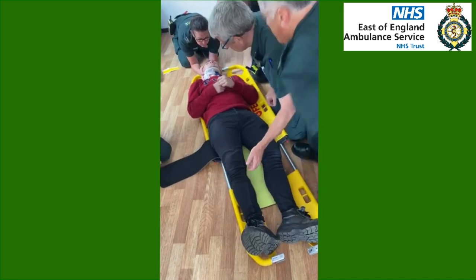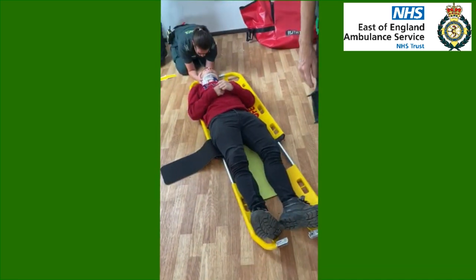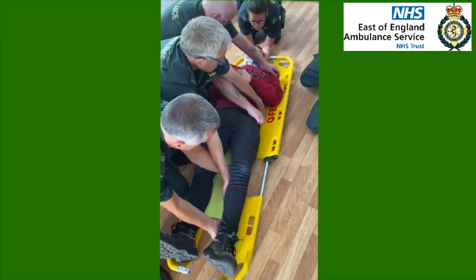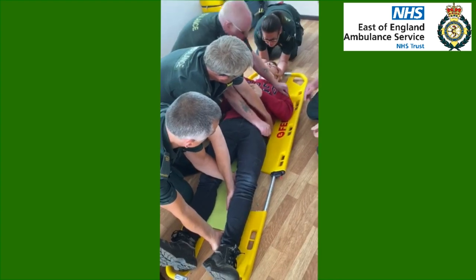If we could maintain your position at the head please and we'll swap round. Okay, same position again please guys, and on your command again Sarah. Everyone hands on. Ready, set, roll.